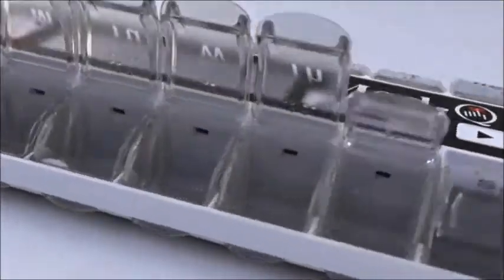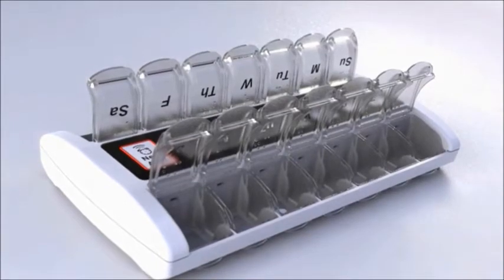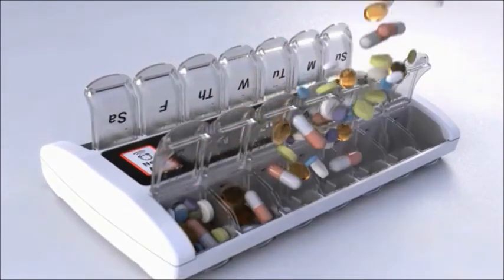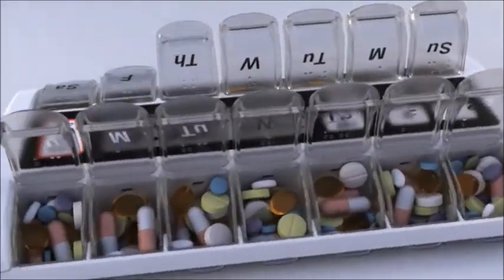Simply open the individual containers using the specially designed oversized fingertip tabs. Place your pills, vitamins and supplements into the appropriate boxes and close the lids.